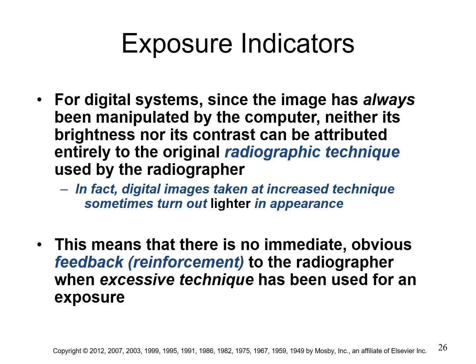But if I divide that range by 3, what do I get? Oh, 50 to 100. How about that? So that's what it does. If you turn in a data set where all the values are about 3 times too high over what the software was expecting, it just divides all your intensities by 3 and then it processes it. It's a software subroutine called automatic rescaling.